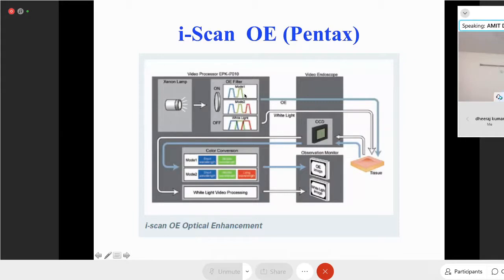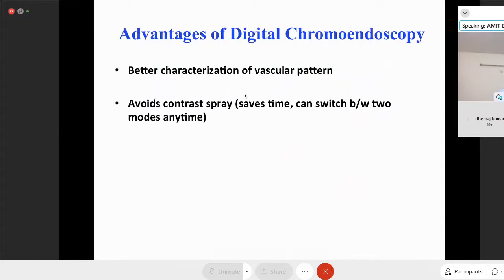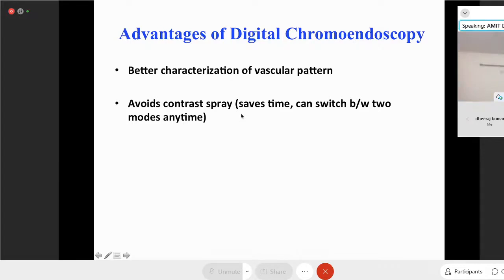What is the benefit of digital chromoendoscopy over dye spray chromoendoscopy? With dye spray you are only looking at the surface, but with digital chromoendoscopy you are also looking at the vascular pattern, giving more information. You also don't spray any contrast. With dye spray, once applied the mucosa gets stained and takes time to clear, but in digital chromoendoscopy you can switch between contrast mode and normal mode as many times as you like. The images are also more magnified, which is why these technologies are more popular currently.